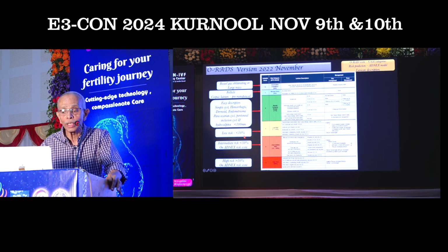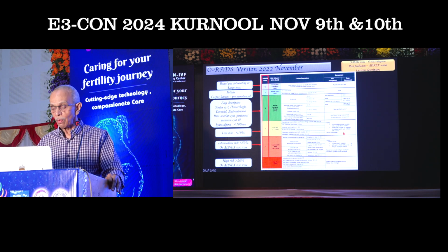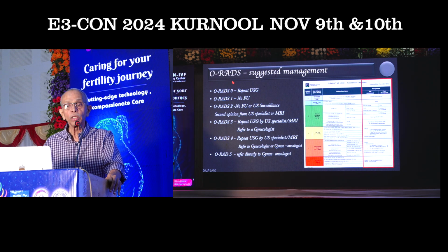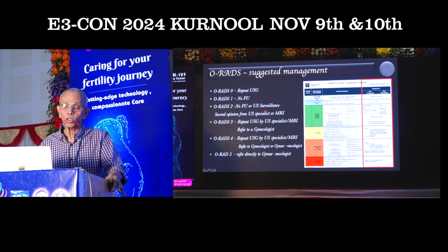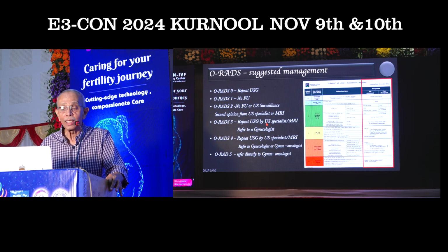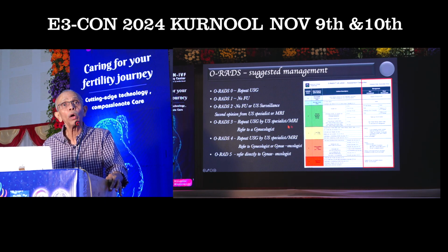Whenever you have a low risk, that is less than 10%, it has to be regularly followed up. Now when it comes to the follow-up as far as the O-RADS is concerned, in O-RADS score 0, repeat ultrasound examination. In O-RADS 1, there is no further follow-up. In O-RADS 2, no further follow-up or ultrasound surveillance, but a second opinion from an ultrasound specialist or an MRI may be required in certain cases.